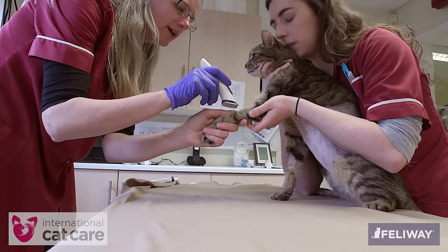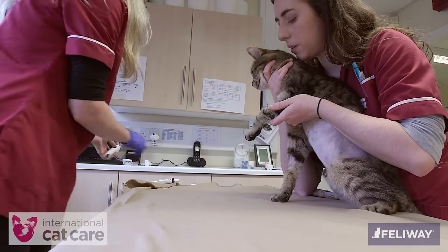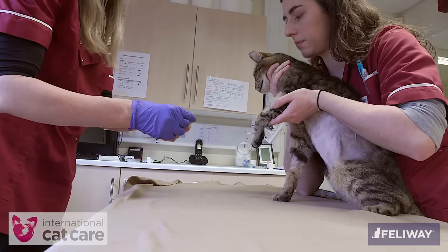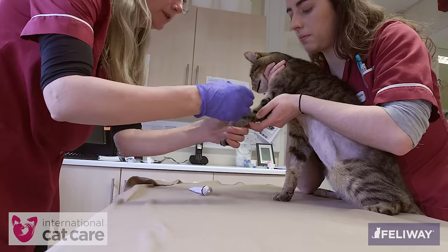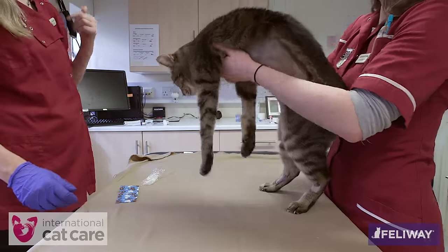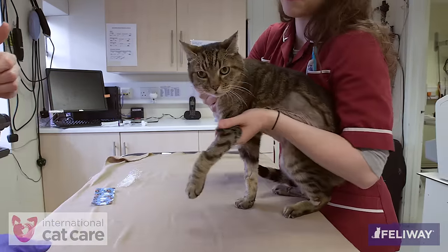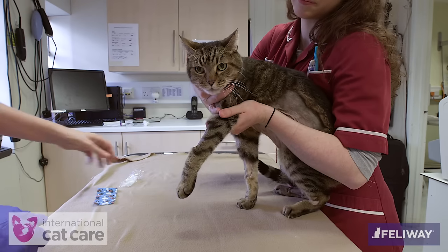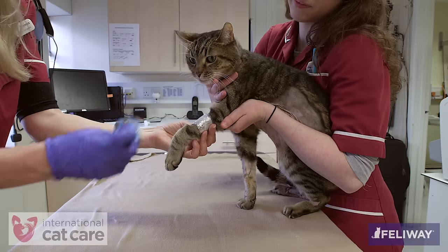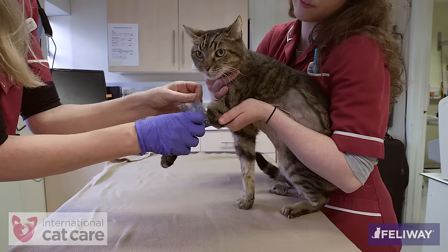Small quiet clippers should be used and start them behind your back to avoid startling the cat. Local anaesthetic Emla cream is applied to the area. Here the cat is given a short break before plastic wrap is placed around the leg and covered with a dressing. Local anaesthetic cream should be left on for at least 20 minutes before the catheter is placed. The cat is stroked or could be offered a treat afterwards as a reward.